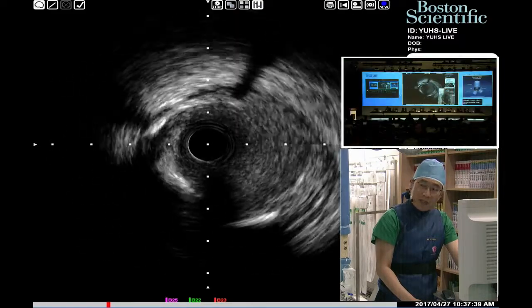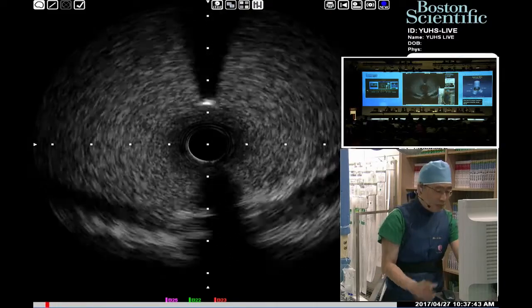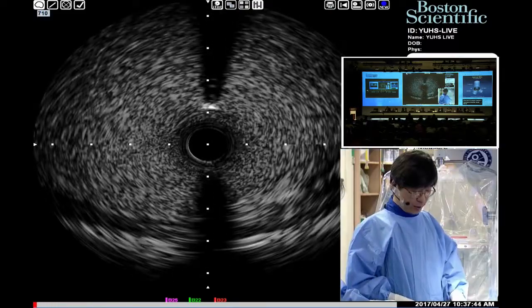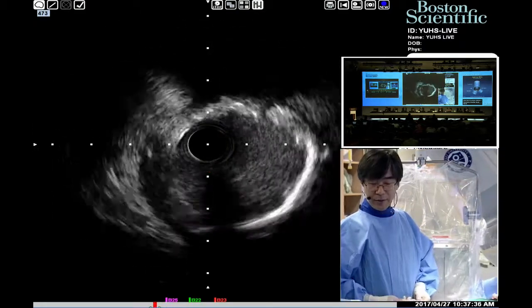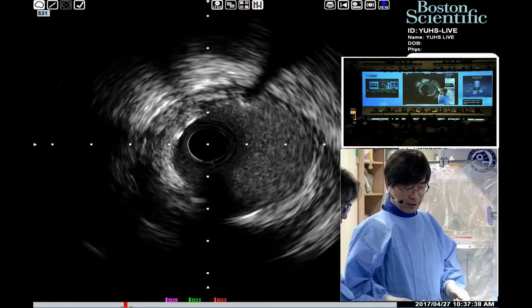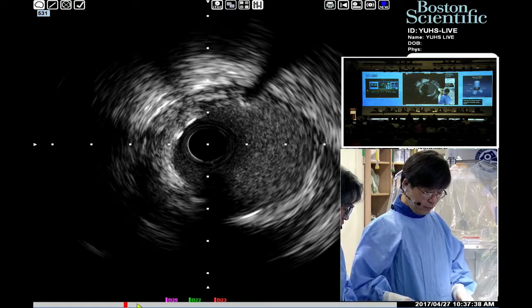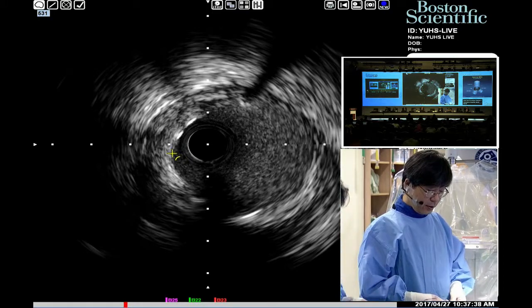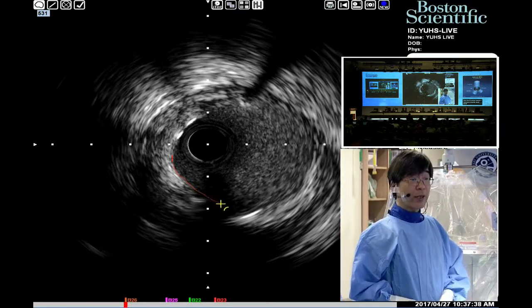Whatever the stent deployed, based on our experience using the BioFreedom, even though we deploy in the left main, we have steadily increased confidence about the BioFreedom. So 1 month later, personally, I think non-cardiac surgery such as spine surgery will be safe.